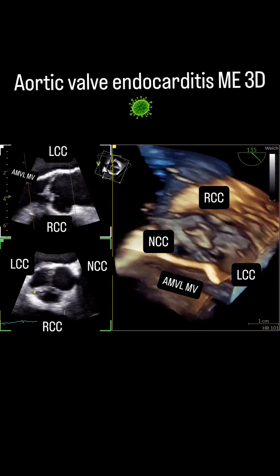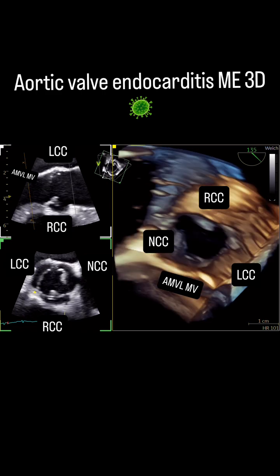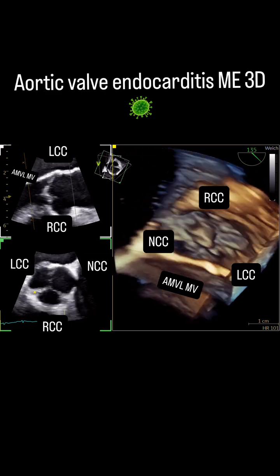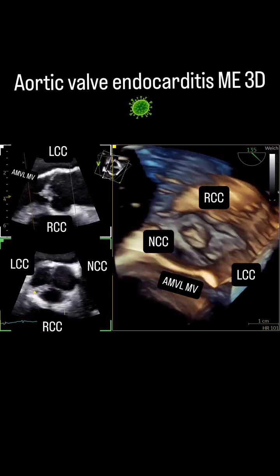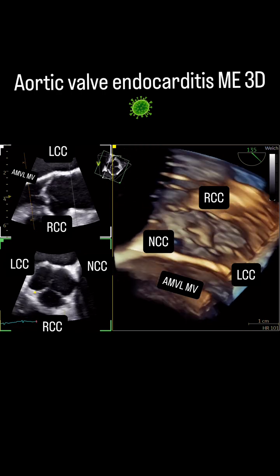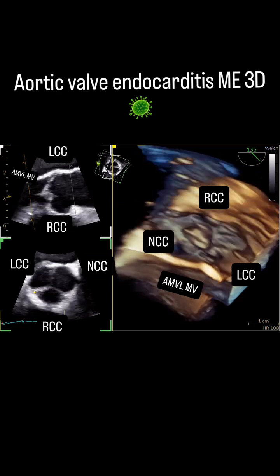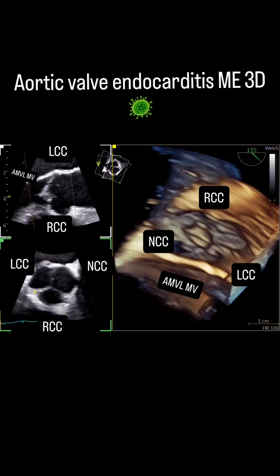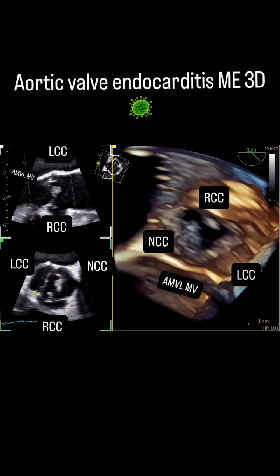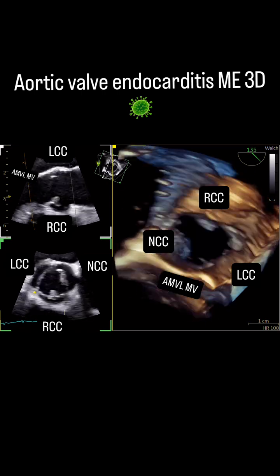Use the anterior mitral valve leaflet to orient where your anatomy is located. Then use the 2D image and the understanding of the 2D images before to identify the non-coronary cusp, the right coronary cusp, and the left coronary cusp. You can see all three cusps also labeled in the 3D image.